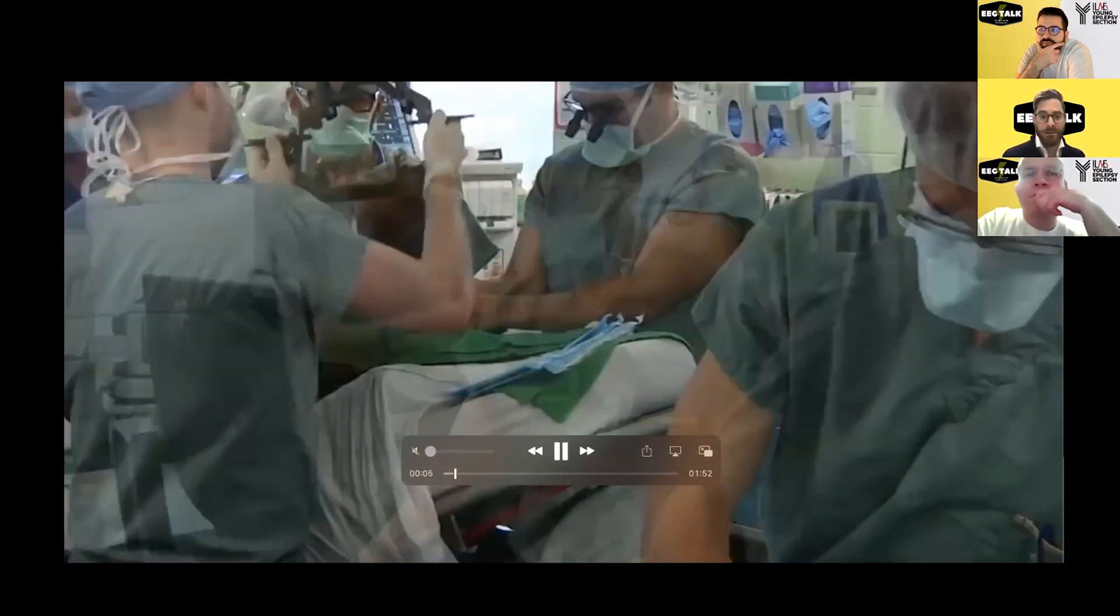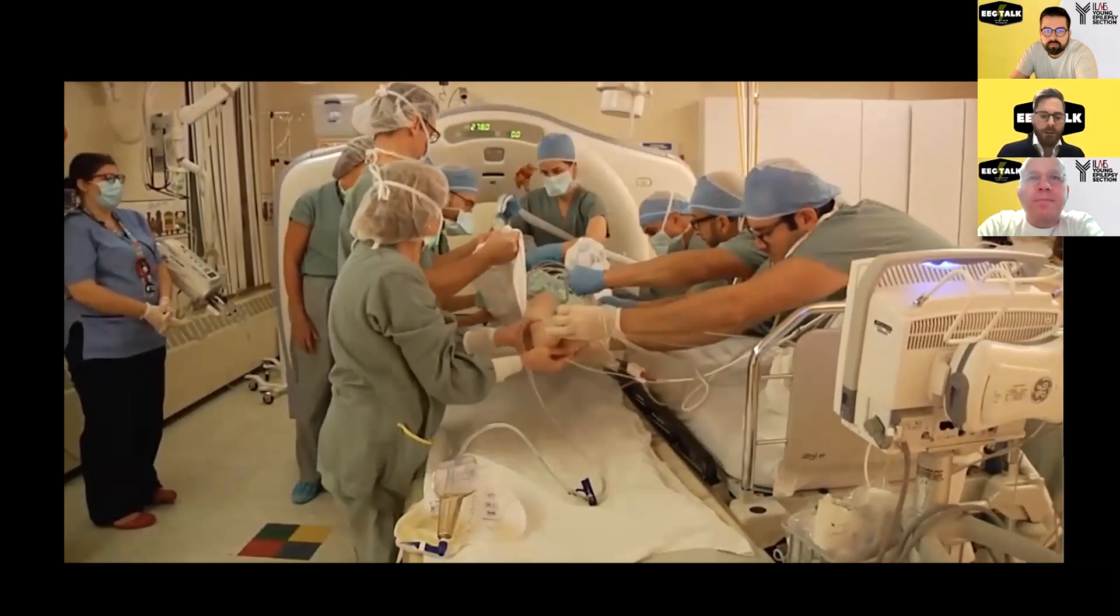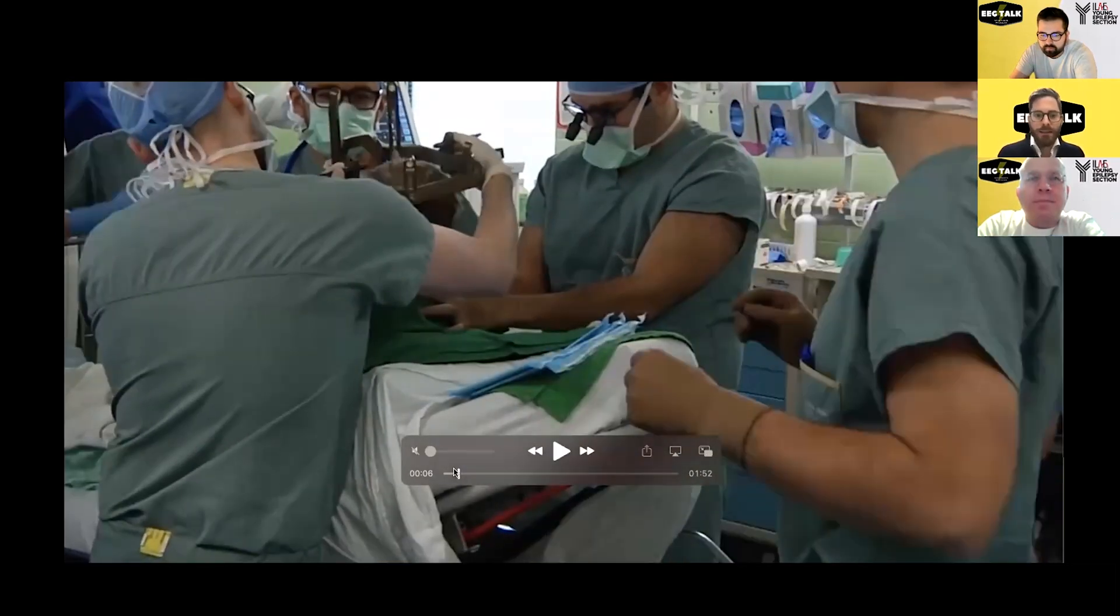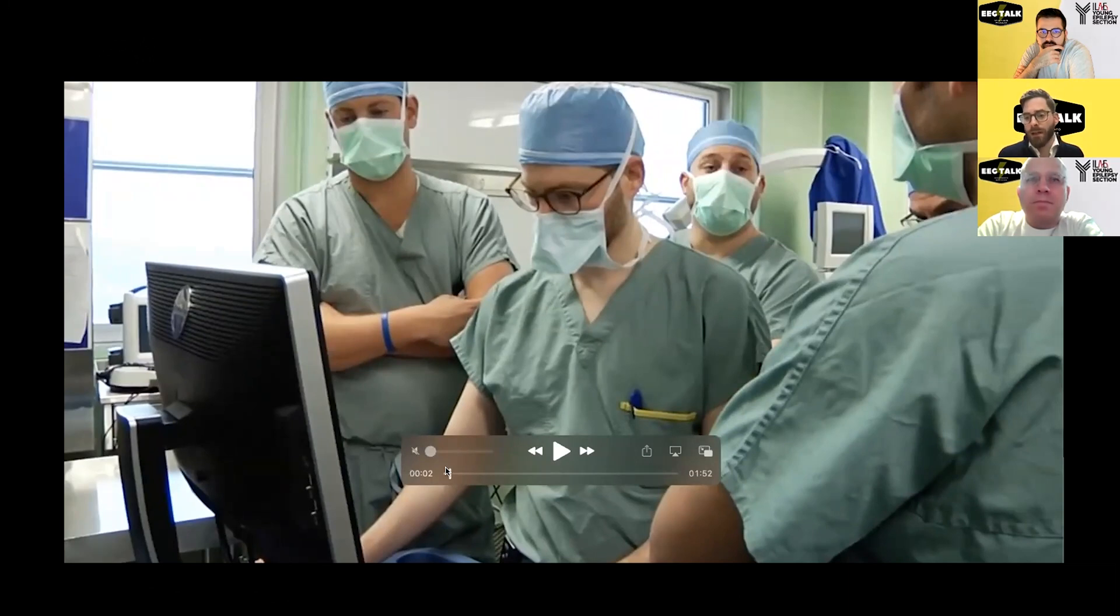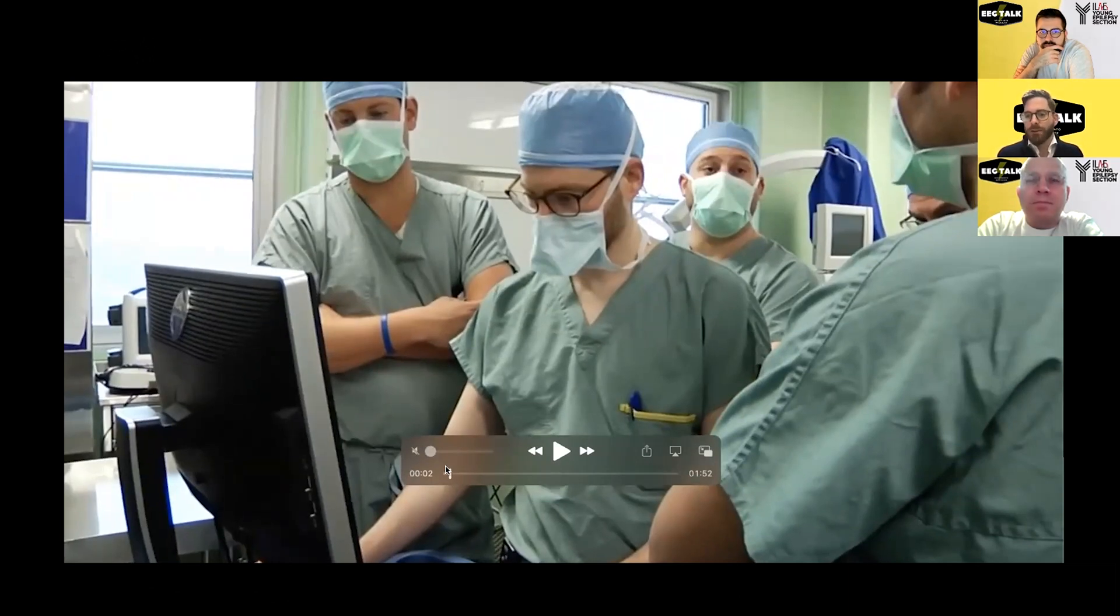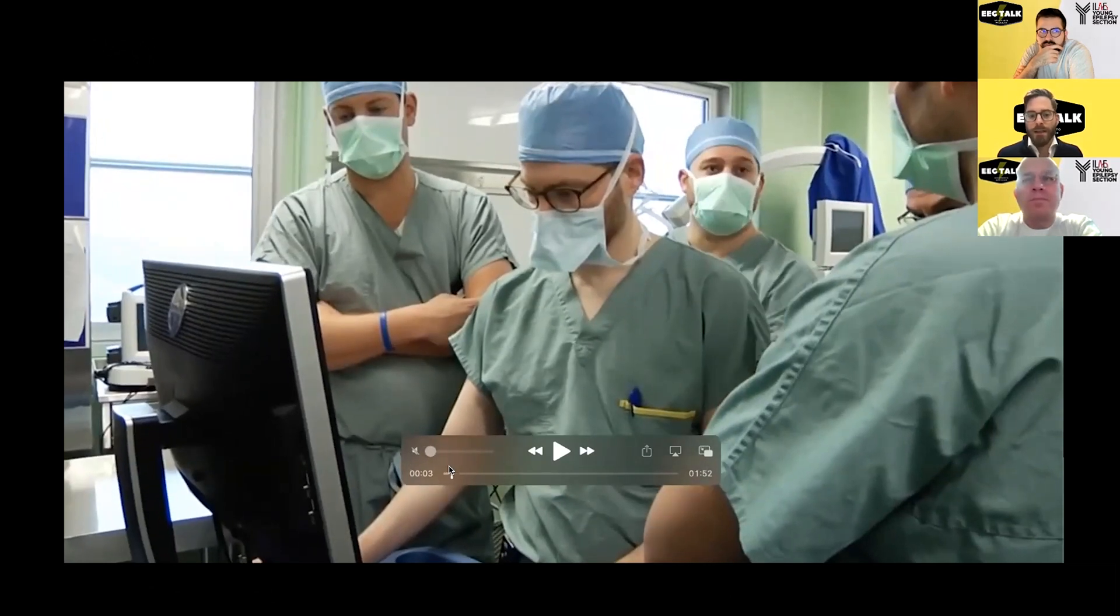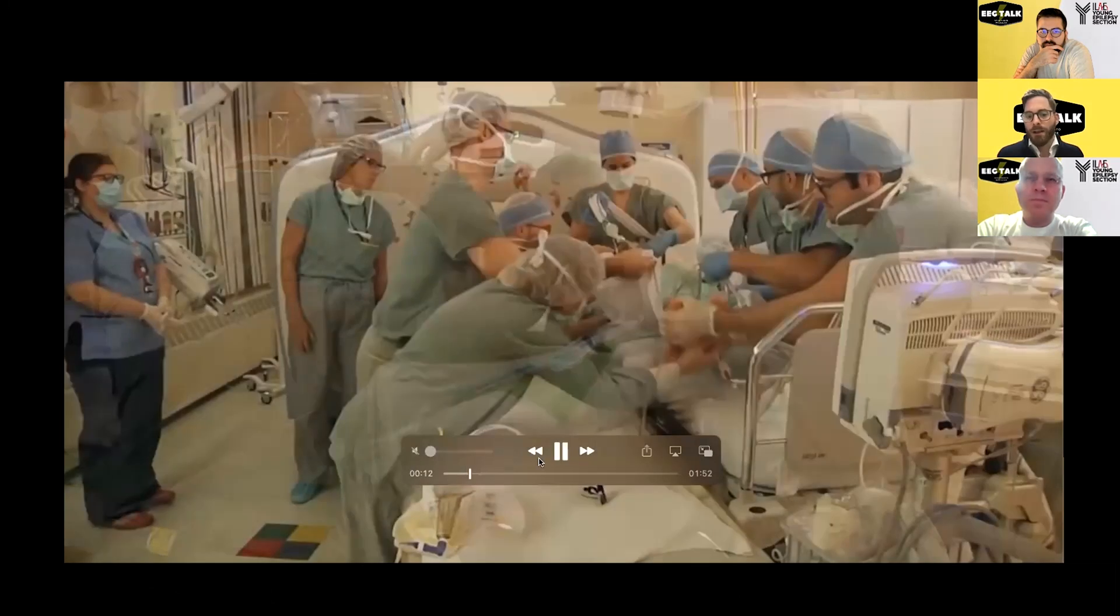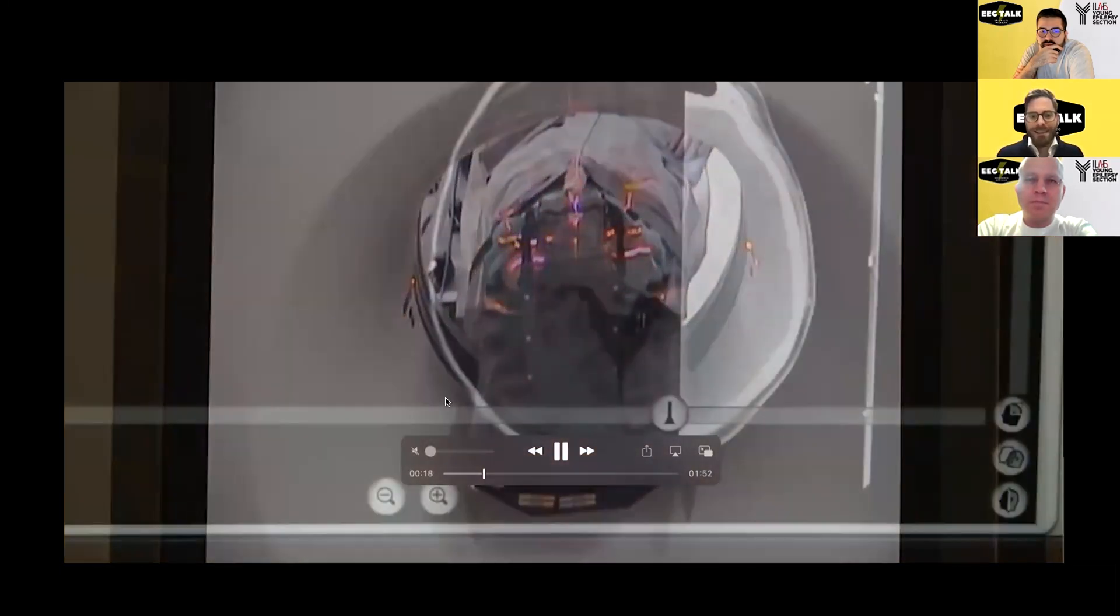The best way to explain the technique for lit is the video. The laser probe of course has to be accurately placed in the epileptogenic foci. That's done with stereotaxy. Frameless stereotaxy is an option, but most cases, and certainly MTLE cases, we use frame-based stereotaxy, which is the neurosurgery gold standard to have accurate placement of a probe. You see us putting on the frame here. What's so important to note is we've already obtained a pre-operative MRI for the patient. We've planned out our entry site and our trajectory and our target pre-operatively on a pre-operative MRI. Then on the day of surgery the patient is placed in the frame and brought to CT scan and we get what's called a frame-based CT scan.